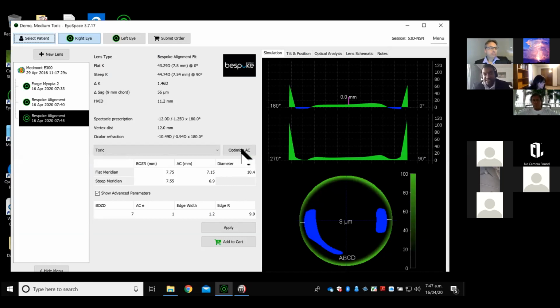Other practitioners that I've seen prefer to fit nearer to 20 microns or more. Just bear in mind that that can also create lens adhesion or lens suction, and could create some forces or changes there. Typically in the old days, we used to call it a spectacle blur, where you'd have the unintentional molding of an improperly fit rigid lens. We don't really see that so much now with virtual fitting, because of the lathe technology, and also the lens designs are coming out significantly better.